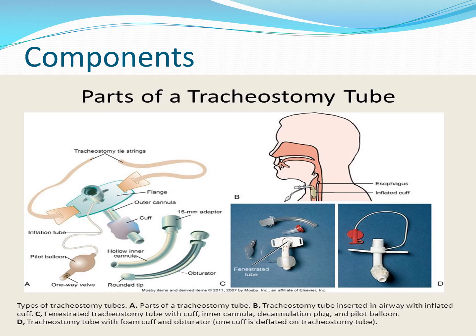And then you have the inner cannula, and near the bottom center, you have what's called the obturator. The obturator has a blunted end that protrudes through the end of the tube to better facilitate the insertion and to minimize or eliminate any trauma from the insertion.